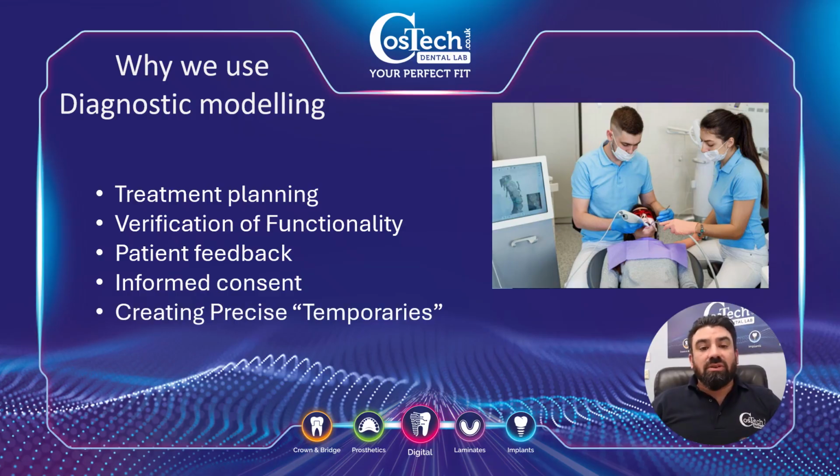It's also very good for very precise temporaries. When you're using diagnostic modeling and you use a putty index to make your temporaries, it gives the patient an idea of what their final smile will be like. So if there is anything wrong, now's a good time to actually change something before we do the final restorations.